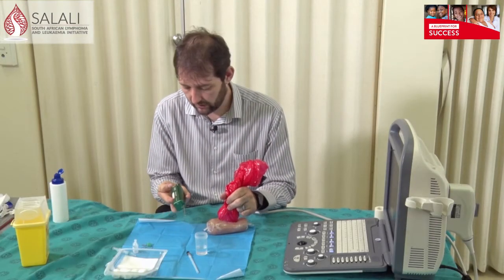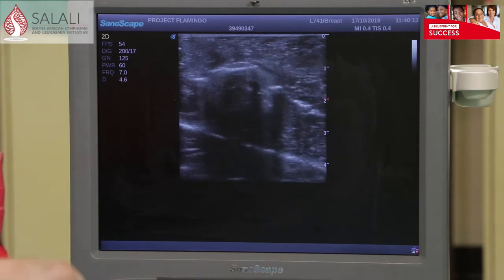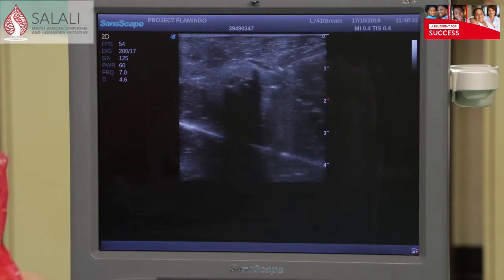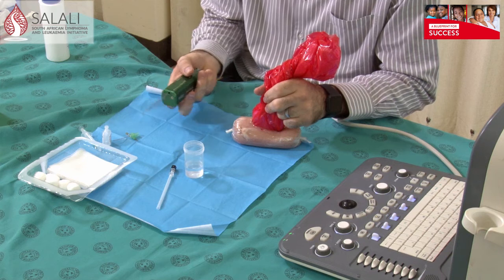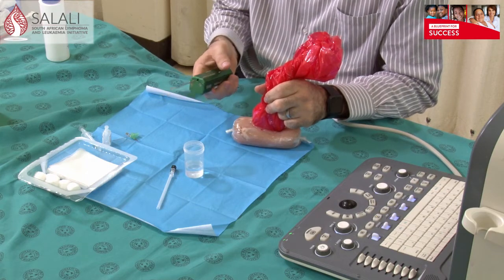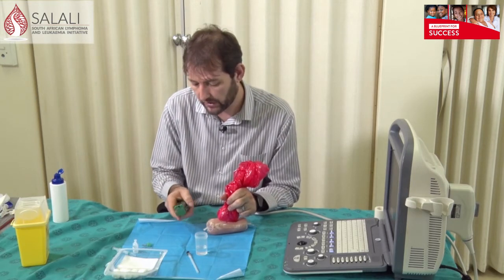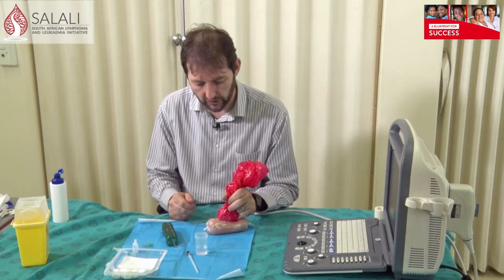Withdraw the needle and open the specimen port to see the biopsy sample, then place it into your specimen pot. Reactivate the needle with the safety off and repeat the process, following the needle into the lesion and firing again. For this olive target you can see a bit of red and green, confirming I've hit the center. Two passes is more than enough — for a breast biopsy two is sufficient. For a soft tissue sarcoma where lots of immunohistochemistry staining is done, you might want a few more, but as a rule two is enough.